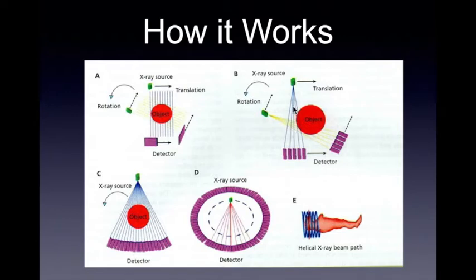When we take that into the aspect of how we could get three-dimensional images, imagine we take an X-ray, place it on a series of detectors, and allow the series of detectors, such as in this diagram, to receive images at different points of the object. Then you see different areas of the object, and it would be detected by the series of detectors.